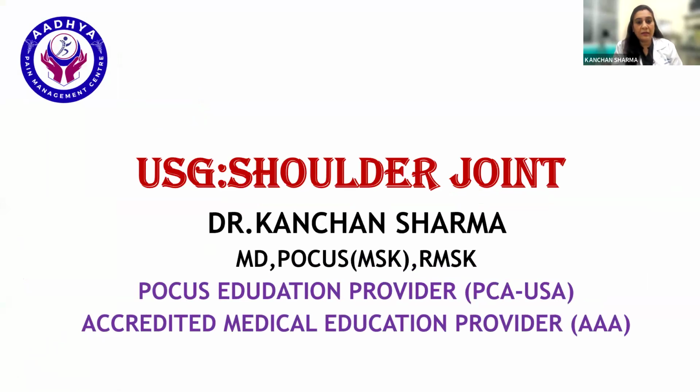We will be discussing 4 pathologies, and they are very, very important if you are really learning the basic pathologies of the shoulder joint. Fine. So we'll first be learning the anatomy. Then I'll be demonstrating the sonoanatomy on the healthy volunteer. Then we will be discussing the pathology of that particular structure, how exactly the clinical presentation will be, and how to go about doing an intervention. So this is the manner which we will be following today.